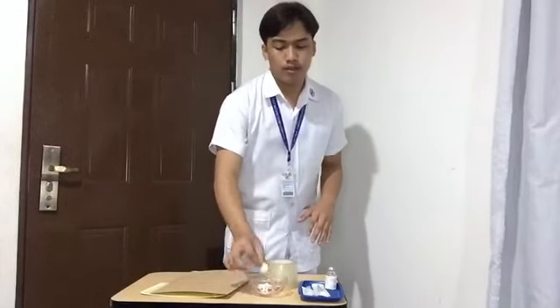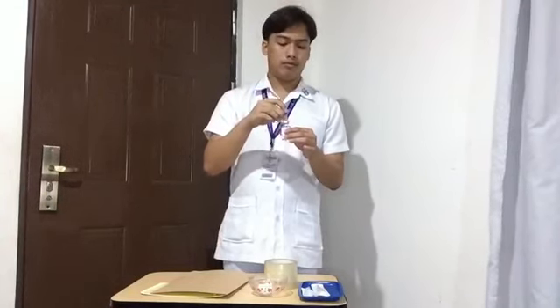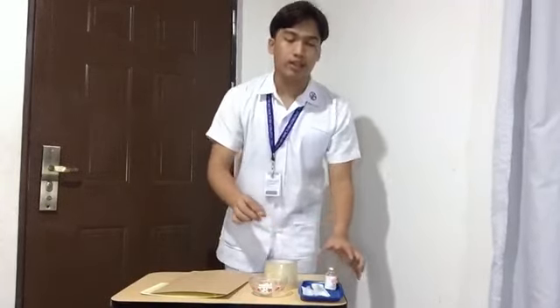Next is remove the protective cap or clean the rubber cap of a previously opened vial with an antiseptic by rubbing in a circular motion. So I am going to wipe the protective cap because it promotes sterility. So I am going to discard this cotton ball. Next is withdraw the medication.